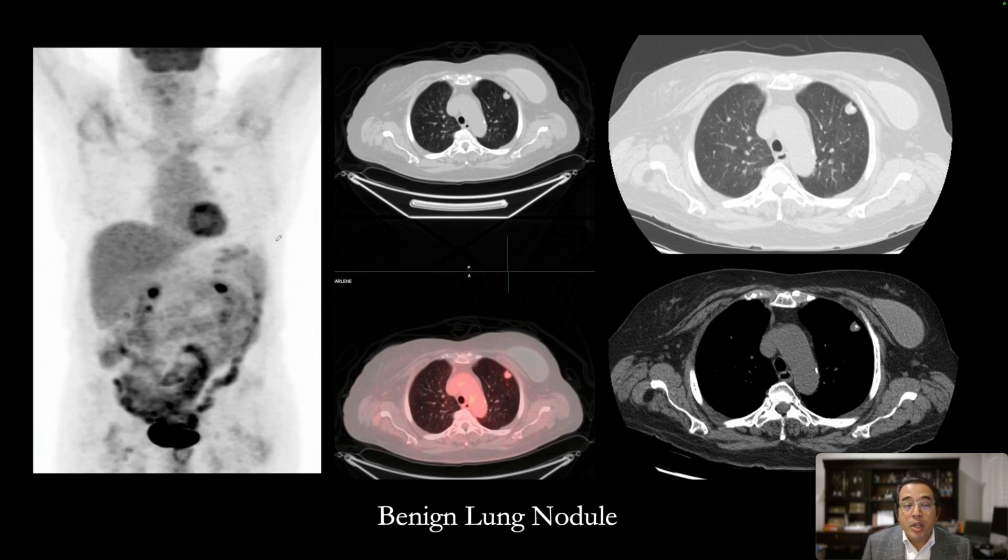The SUV measured 1.8, and here's the appearance of the nodule on the CT, showing mild uptake on the FDG PET-CT image. The diagnostic CT showed the nodule. It measured a little more than a centimeter.